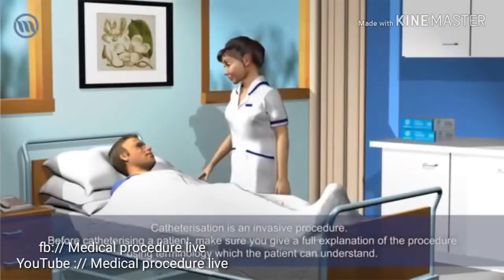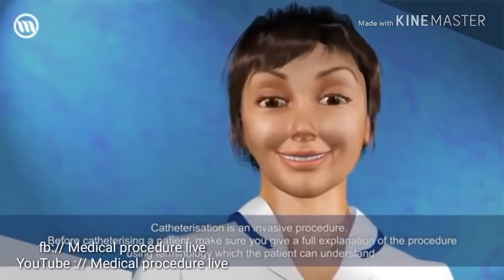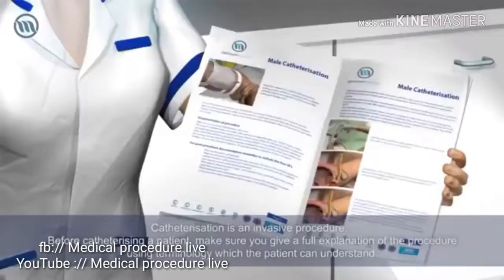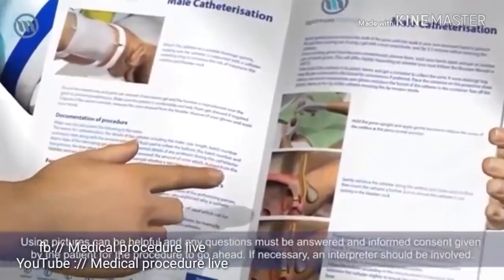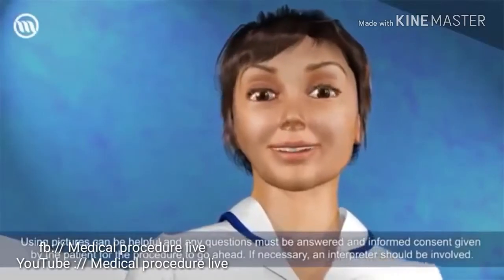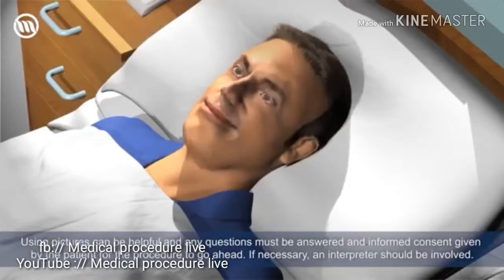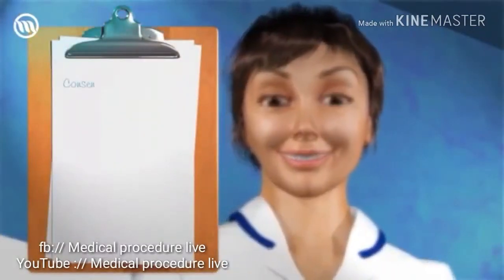Catheterisation is an invasive procedure. Before catheterising a patient, make sure you give a full explanation of the procedure using terminology which the patient can understand. Using pictures can be helpful, and any questions must be answered and informed consent given by the patient for the procedure to go ahead. If necessary, an interpreter should be involved. A clear explanation and reassurance can help to reduce anxiety and enable a more comfortable insertion of the catheter.